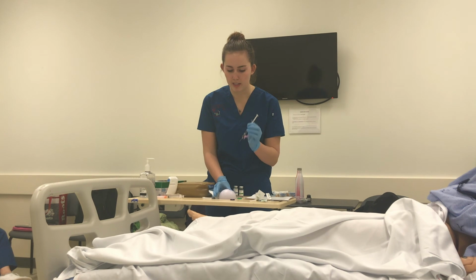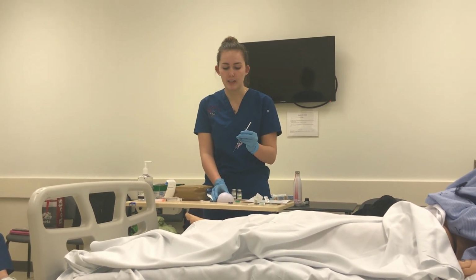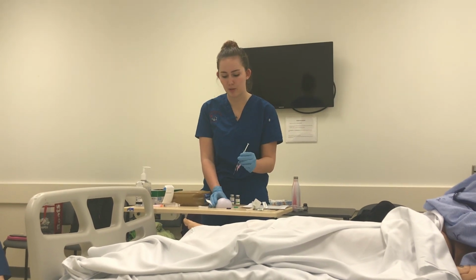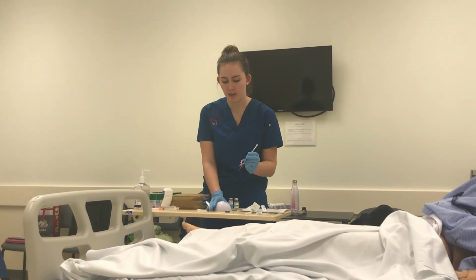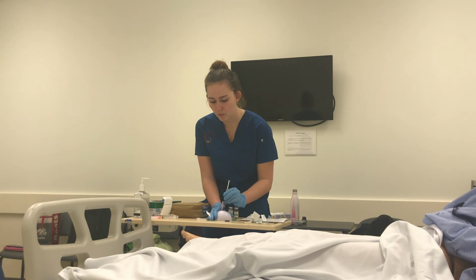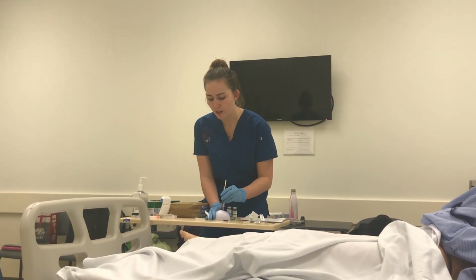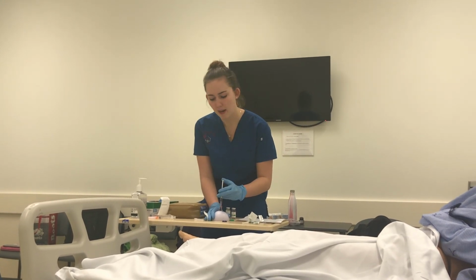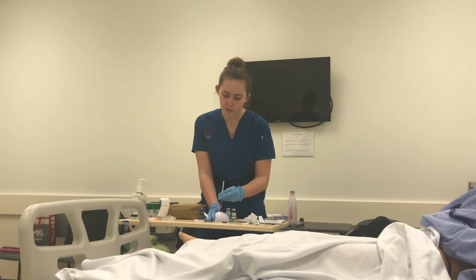However, we're going to insert it in a dart-like motion and insert it 1 milliliter every 10 seconds. So we're just going to make sure to hold it for 5 seconds. This is 0.5 milliliters. And first, before we inject it, we want to make sure we aspirate to see if there's any blood. If you feel resistance, that means you are hitting muscle and not a vein or anything like that. If I did see blood, I would take out the needle and restart the whole process.